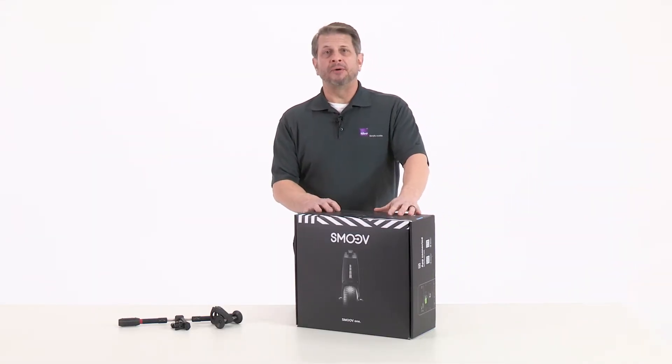Hello, my name is Bill Russell with Alber and Invacare, and today I'm excited to introduce you to the newest member of the Alber powered assist family, the SMOOV One.